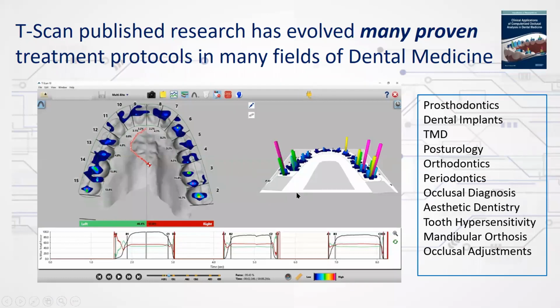And so once you learn how to use it, you can fix a lot of things in a lot of different fields. And again, one of the beauties of the T-scan, as I said, is you can incorporate an STL file, which really simplifies locating where this contact is in the mouth. But even the T-scan arch is customizable. You can shrink it, size it, take out teeth, notate implants, put in edentulous areas, all kinds of things you can do to the T-scan arch that make it possible for you to locate exactly where the problem contacts are.